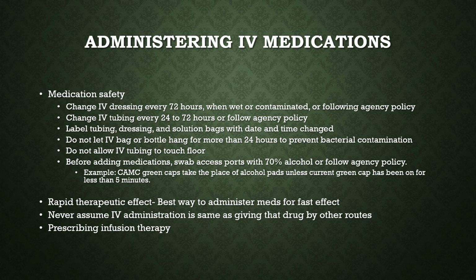Okay, administering IV medications. Some important things to know about administering medications. First of all, if you have an IV bag that's infusing continuously, whether it has some medication in it or whether it's just IV fluid, both the bag and the tubing need to be changed periodically because they do become contaminated by bacteria, especially anything that has sugar in it. And anything with sugar in it is going to become contaminated even faster because obviously that is a medium for bacteria to grow.